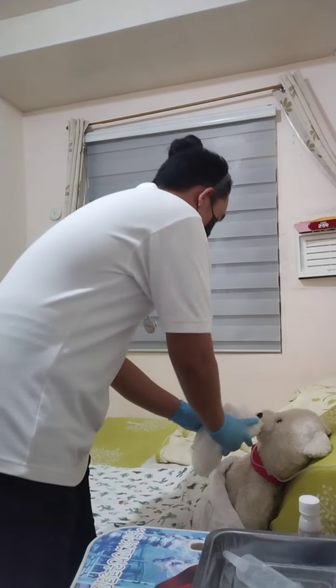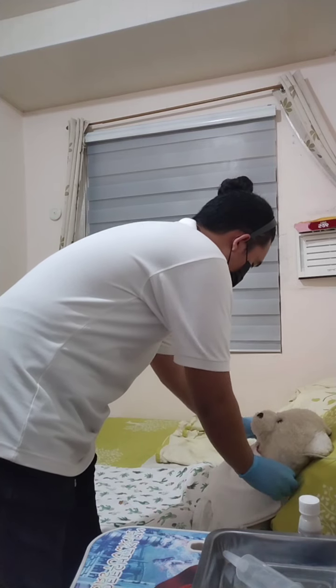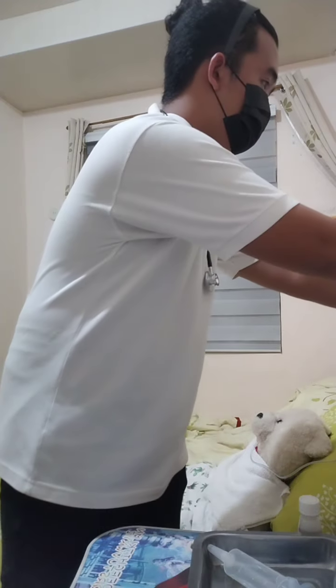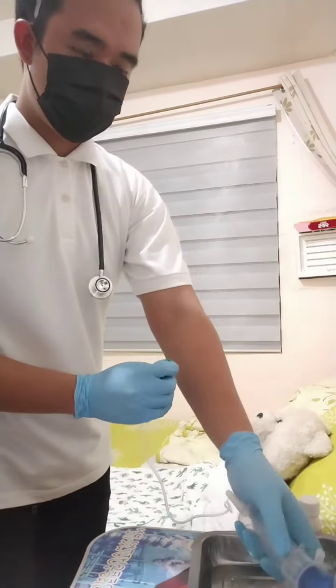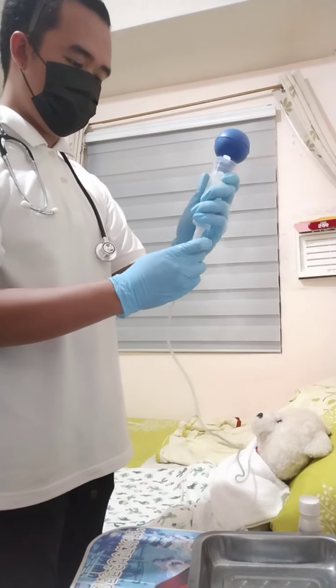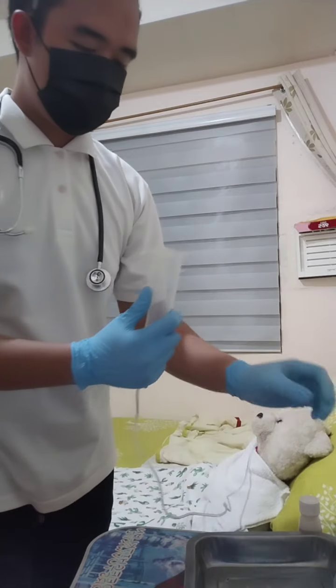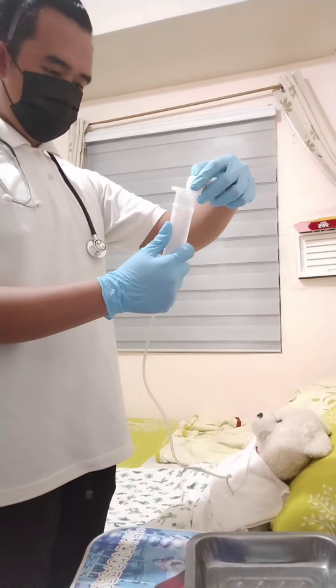Initiate feeding. Bolus or intermittent feeding. Pinch the proximal end of the feeding tube. This prevents air from entering the client's stomach. Remove the plunger from the syringe and attach the barrel of the syringe to the end of the tube. Fill the syringe with a measured amount of formula. Release the tube and hold the syringe high enough to allow it to empty gradually by gravity.